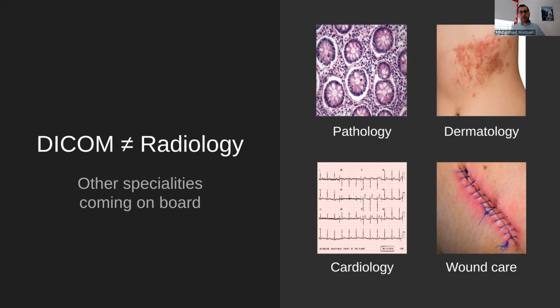Sometimes you hear people calling it enterprise imaging. That's basically what it is. It's the idea of bringing the entire patient record, all their images, everything, into one place, so it's easily found.